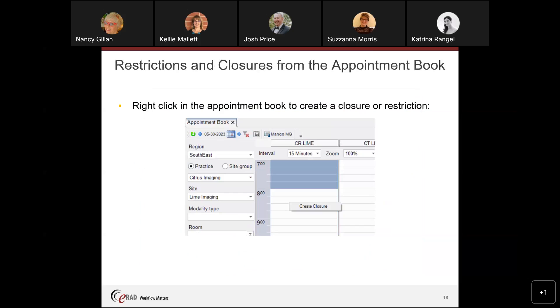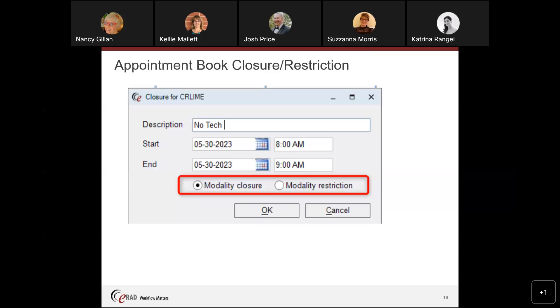You can also create a closure directly from the appointment book by right-clicking in the time slot and selecting create closure or restriction. For example, if a tech has a doctor's appointment and isn't available from 8 to 9, you'd choose modality closure so nothing can be scheduled. A restriction would be used for softer situations — like the tech isn't feeling well, or you want to prioritize biopsies but still allow other scheduling if no biopsies are booked. That can also be done via procedure availability. It's more of a warning to make staff think about why they're using that time slot.